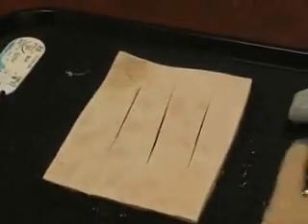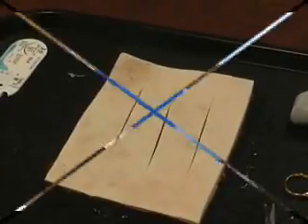Everybody should get an opportunity to be the everter or the stapler and to remove some of the staples.